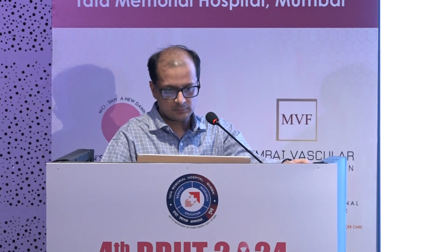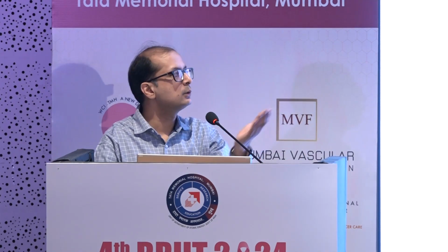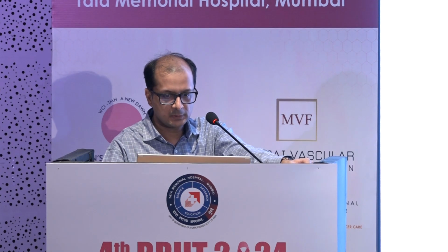And this is how the cutting edge of the needle is. So this is how we can maneuver accordingly, wherever the lesion is located. But on ultrasound, it's always at 9 o'clock to 3 o'clock position. This is how the vacuum is happening, and then you can rotate it and suction out all the hematoma or everything.